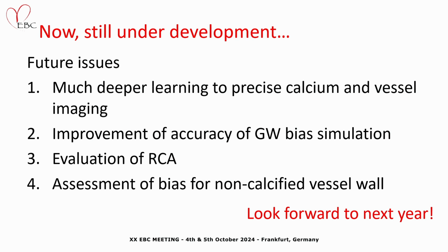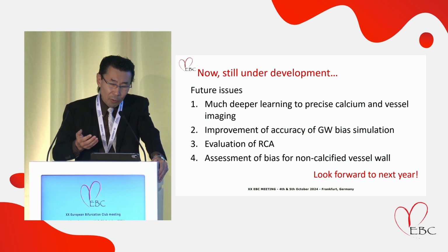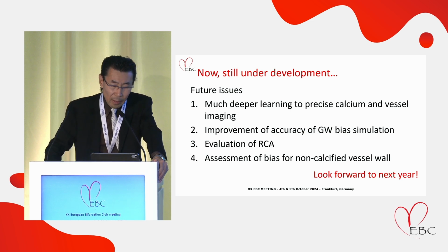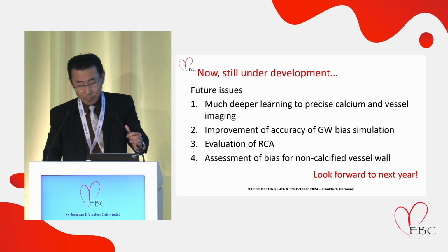The assessment of the bias for the non-calcified vessel wall is also important, because we should avoid vessel wall injury by the atherectomy device. Thank you very much for your attention.